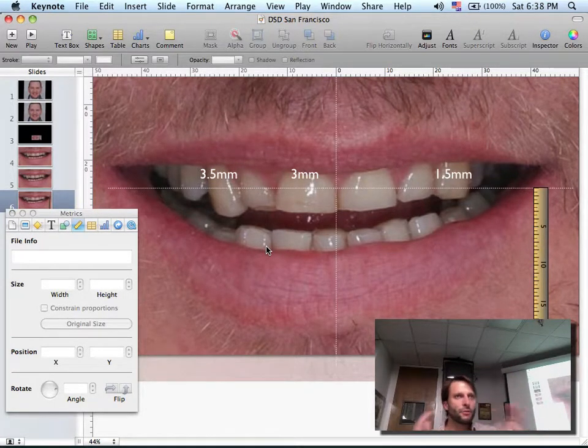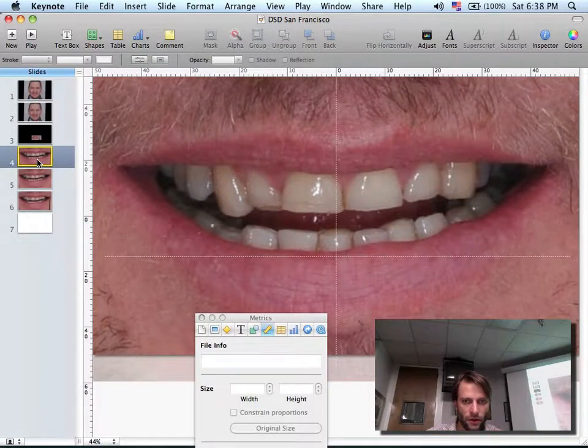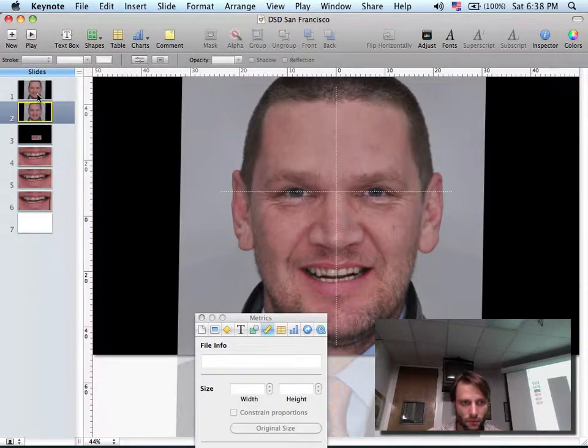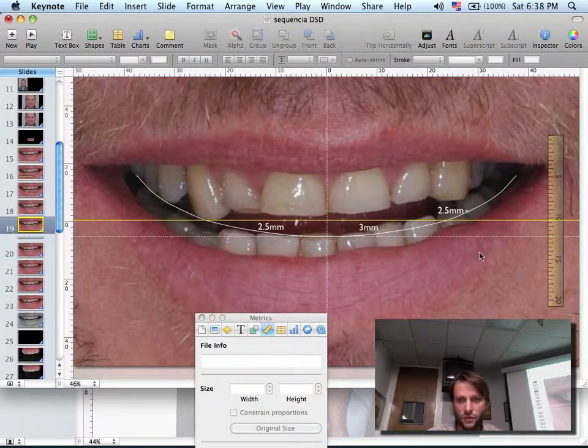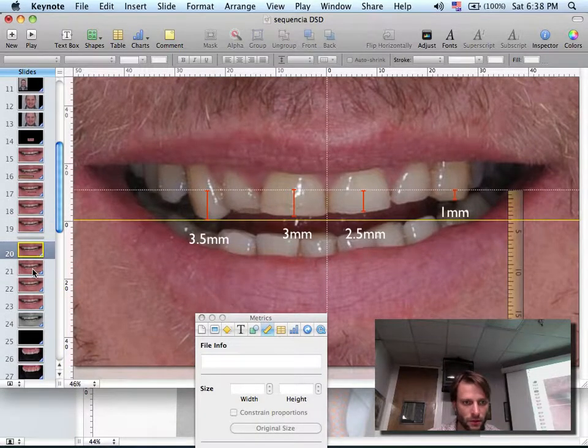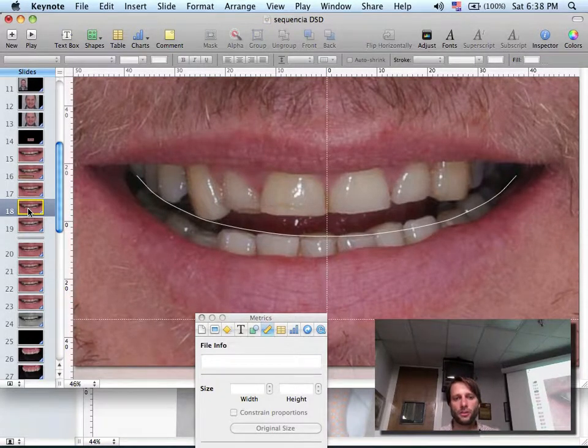Okay? So now I'll move to the posteriors, and I will first do the buccal of the uppers. According to the curve that I determined on the 6 anteriors, I will follow by looking at the pictures and looking at the drawing that we did. Where's the drawing? Oh, we didn't do it. I just showed the drawing. Okay. So according to this drawing, I will wax up the bicuspids.